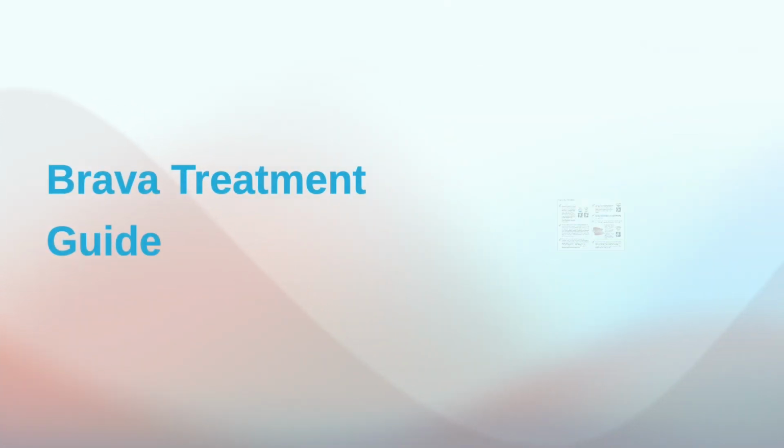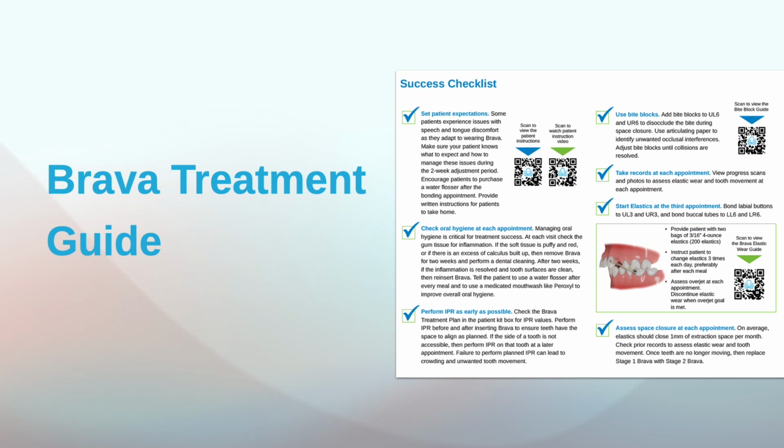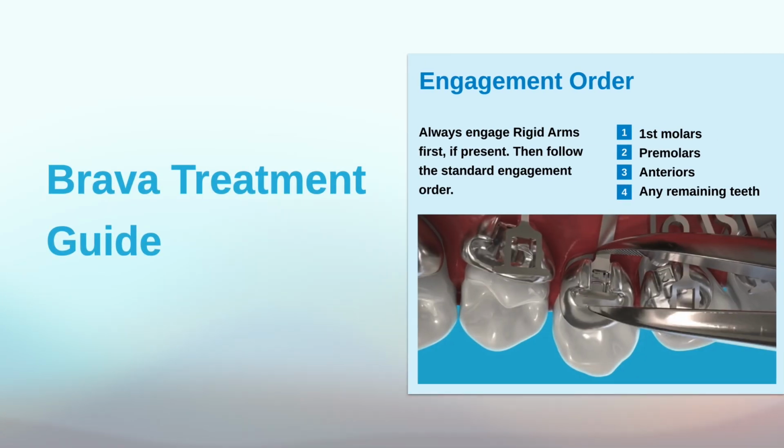The treatment guide also provides a success checklist with helpful tips and QR codes that provide access to additional information. Each treatment guide shows the engagement order by tooth. Following the recommended engagement order simplifies the insertion of Brava clasps into brackets.